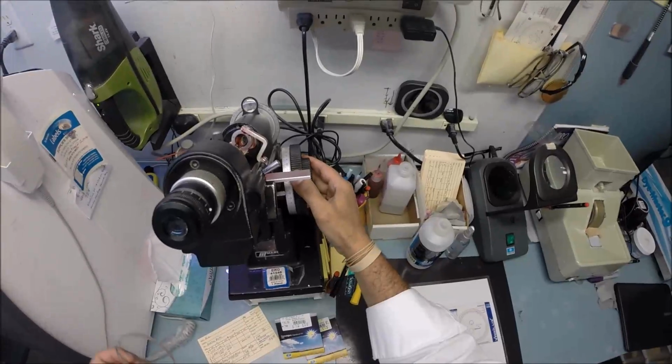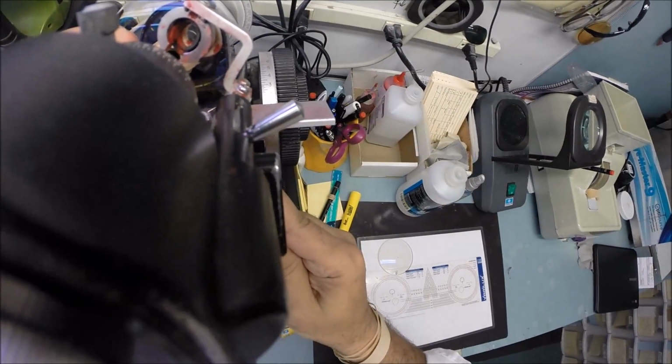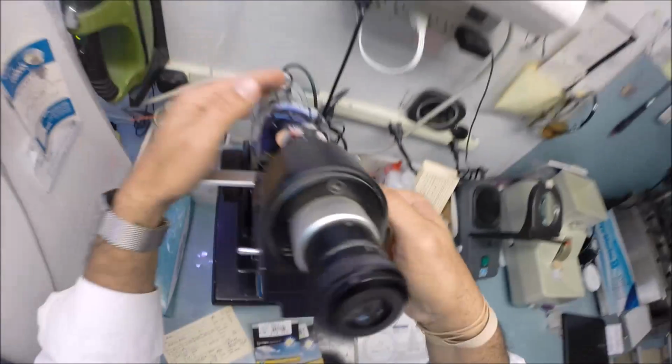All right, so let's put on -2. Rotate the lens till the sphere power comes in clearly. Find the optical center of the lens, which just happens to be the middle of the lens.